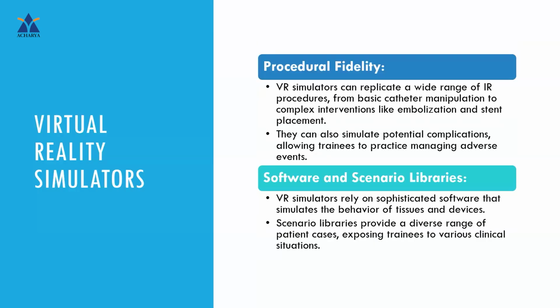These VR simulators can replicate a wide range of procedures, from basic catheter manipulation to complex interventions like embolization and stent placement. They can also simulate potential complications, thereby allowing the trainees to practice managing adverse situations.